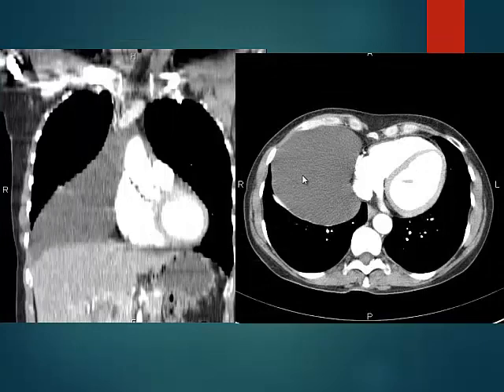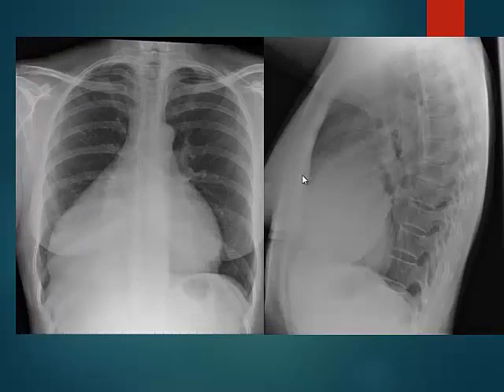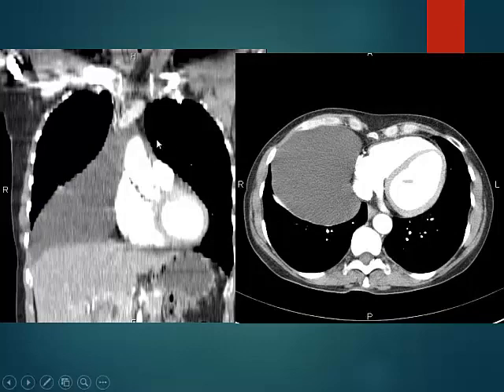Okay, so what is this? It's a pericardial cyst. Yeah, it's a large pericardial cyst, which was on the X-ray. If you go back to the X-ray, it looks almost like, you could say dextrocardia also, I think. It's a large pericardial cyst. Other differential of this would be a large thymic cyst, because it's going to the mediastinum. You can see here, all the way up.